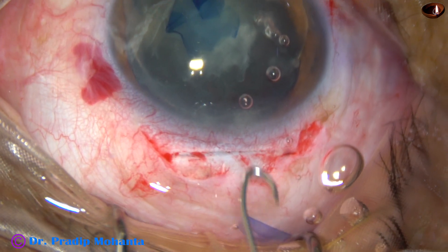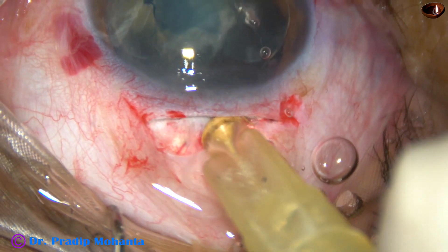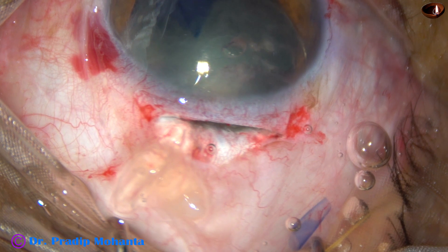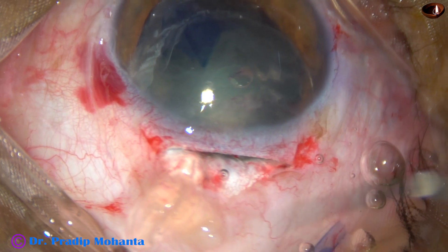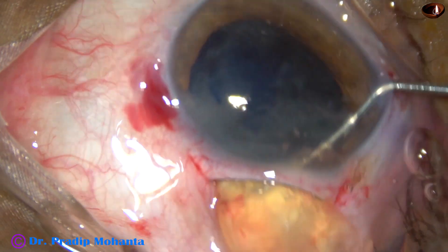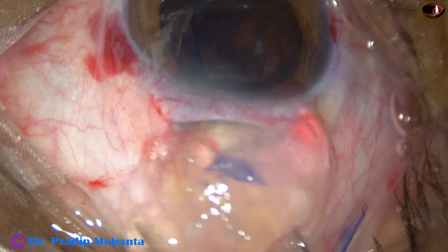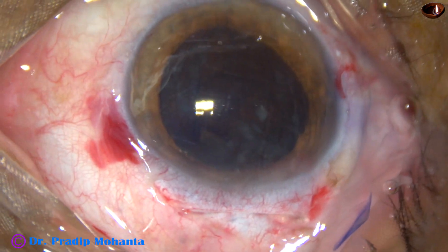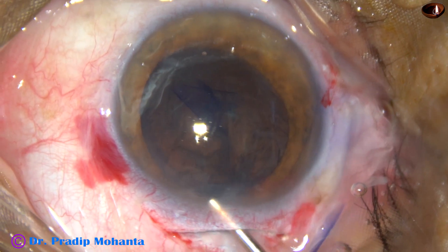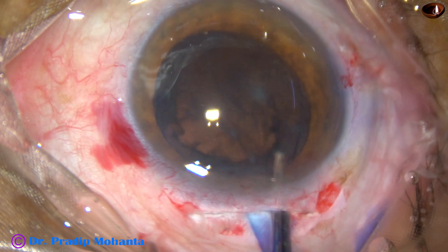I am using a fish hook. Let us see if we can use this fish hook and deliver the nucleus. Go like this, turn it towards the nucleus, and pull the nucleus. In this case the nucleus didn't come out but is engaged in the tunnel. When the nucleus is engaged in the tunnel you can push it from behind from the anterior chamber with a Sinski hook or a blunt chopper and deliver the nucleus. Now press the inferior posterior lip and the rest of the lens matter comes out. Inject some more viscoelastic and now whatever lens matter is left is to be removed.